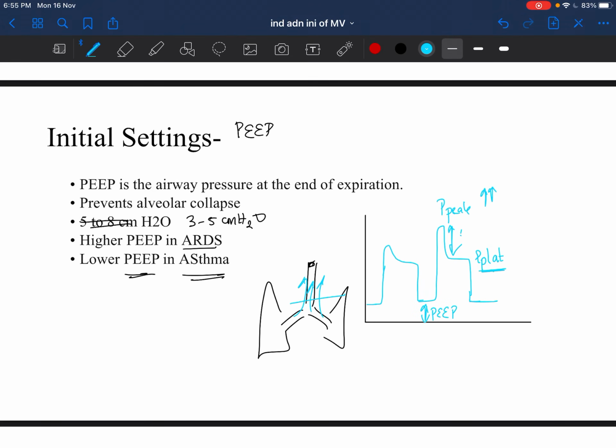If the patient is not allowed to exhale completely, then some amount of air is still going to remain inside the patient, resulting in elevation of this baseline. And this goes on increasing. Similarly, your flow is supposed to touch the baseline, isn't it so?